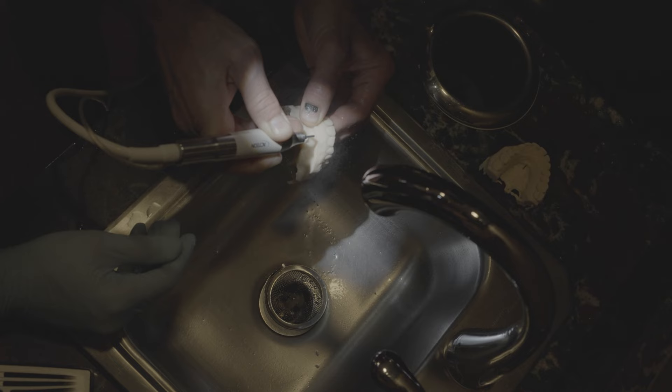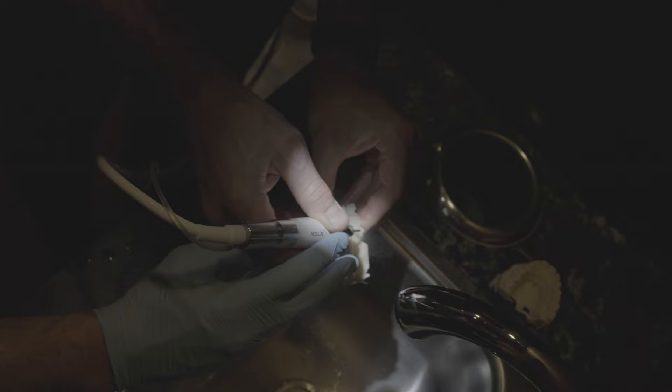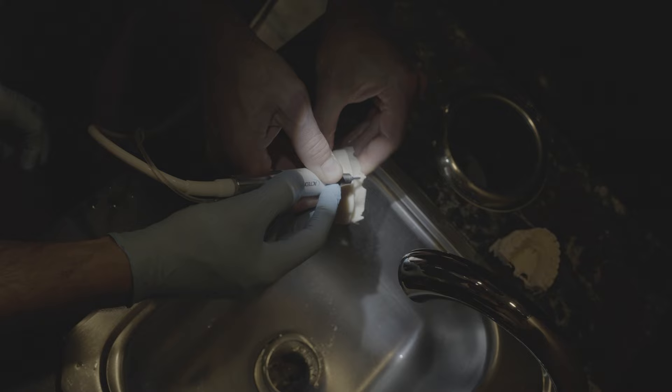You see how it kind of dropped in? Usually at that point I would always go this way because this just gives me a better angle. And then you could just go all the way like this — and that's the extent of the front cut.